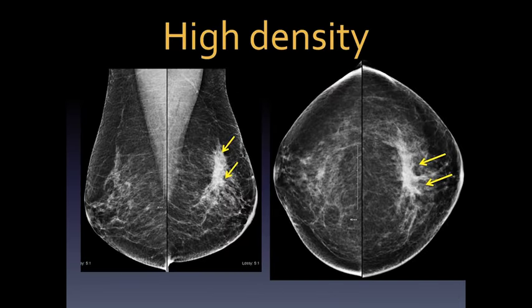Here are some punctate calcifications — very difficult to characterize. There is a small percentage that do turn out to be malignant, so if they're new they should be biopsied. This patient did not have a biopsy, and one year later she developed an invasive ductal carcinoma at that site. So be careful if they're new — you should biopsy them, but they may often be benign.